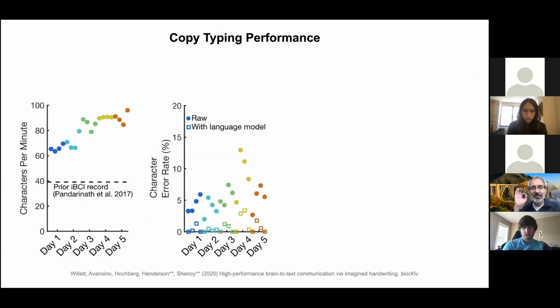Okay, so what I'm going to show you now is the raw data though. Okay, the raw signal, because we can always clean up from there. So what we did was we ran this for 5 days in a row, okay, in this data shown here.